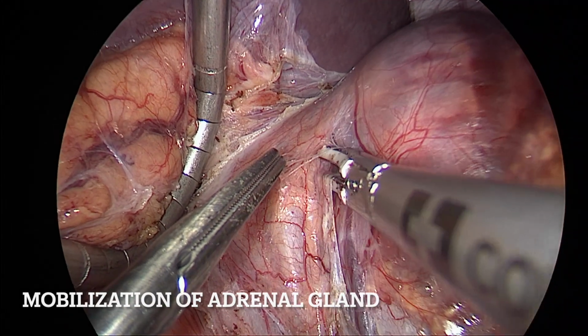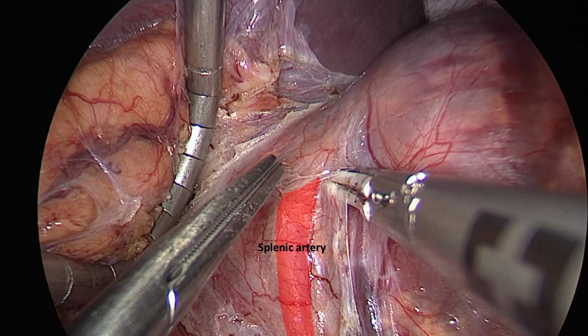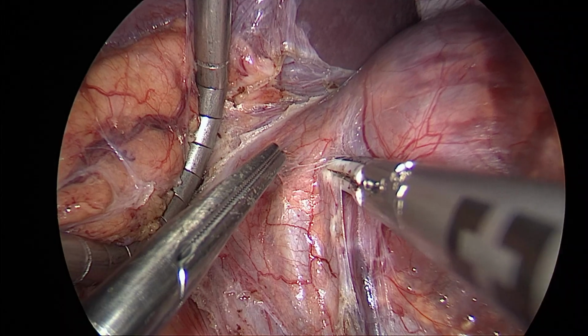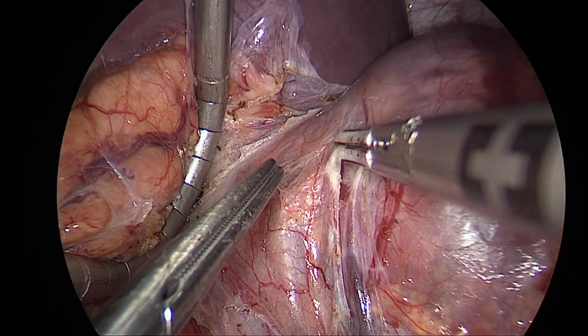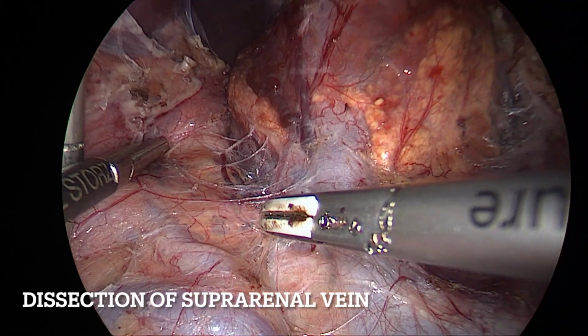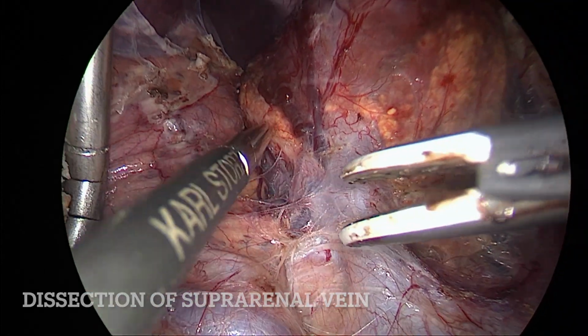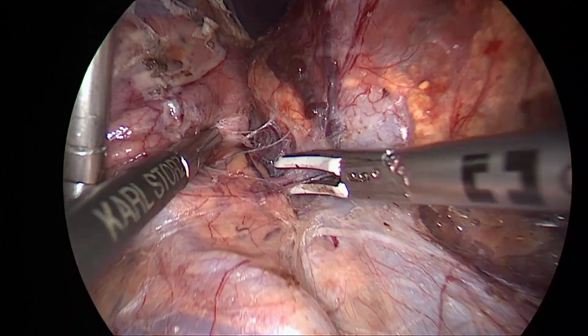The stepwise mobilization of the suprarenal gland carrying the pheochromocytoma was performed moving cranially and dorsally toward the diaphragm, carefully avoiding the pulsating splenic artery. Before ligation, the suprarenal vein was gently dissected to avoid excessive adrenal hormone release.